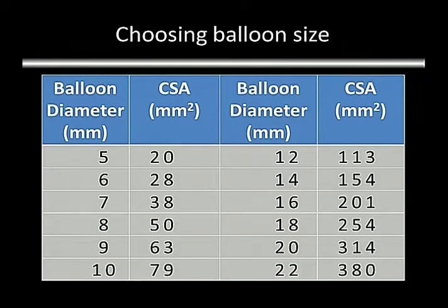I had this epiphany one evening. I woke up and said, that's what I've got to do. I've got to measure the cross-sectional area of every balloon, because all the balloons will form a sphere and they'll be completely circular, but the veins are not necessarily circular at all. They can be very oval, up to a 2-to-1 ratio, actually. So how do you pick which of those diameters to use?